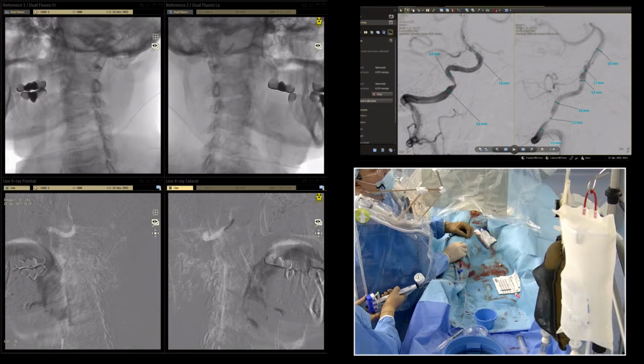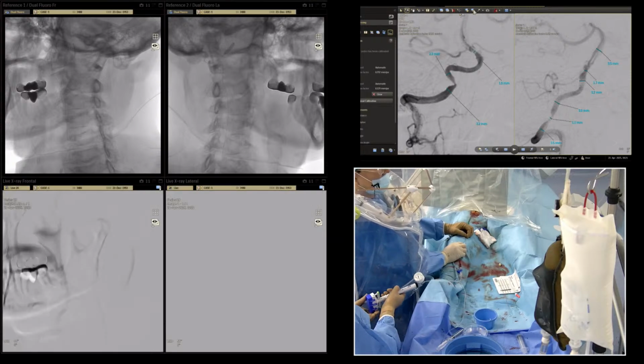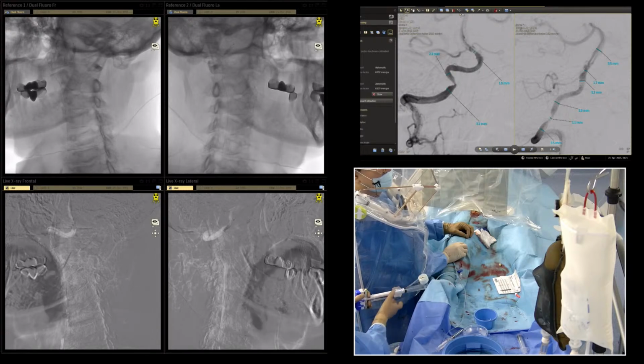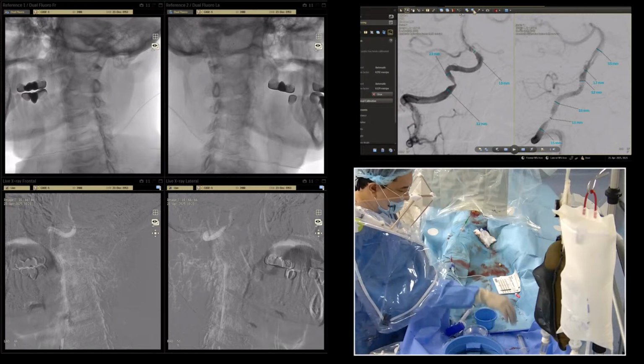Okay, let's wait. Қазір. Так, сдвой. Okay. Let's do an angio.